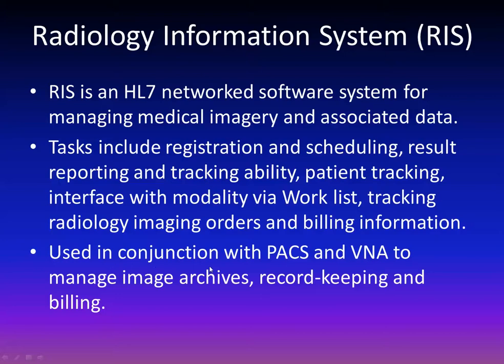The RIS is used in conjunction with the PACS and, like we just talked about, a VNA, vendor neutral archive, to manage the archived images, record keeping, and billing.